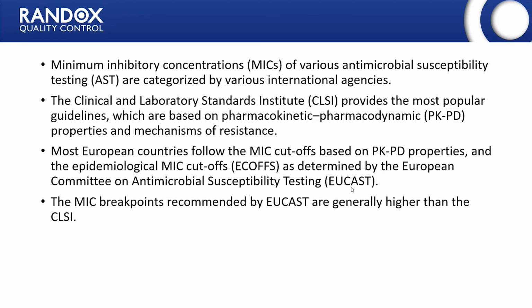So it's important, as I say, that we're using the guideline, and the guidelines are what we are using in this next section. So why I put those couple of slides up was just really to highlight the importance of these MIC and the guidelines that the labs use to determine the susceptibility of the organism to the antibiotic. They will be different. As I said, the breakpoints recommended by EUCAST are generally higher than the CLSI. So you will potentially get different results depending on what guidelines are in use in the lab.